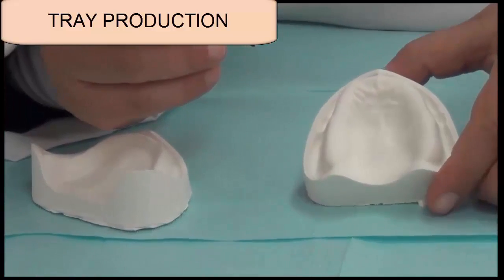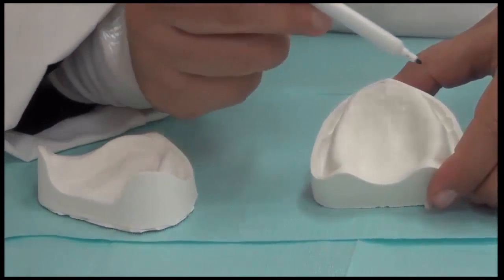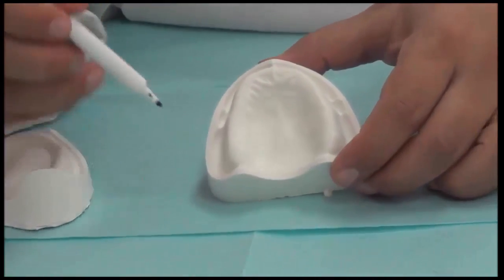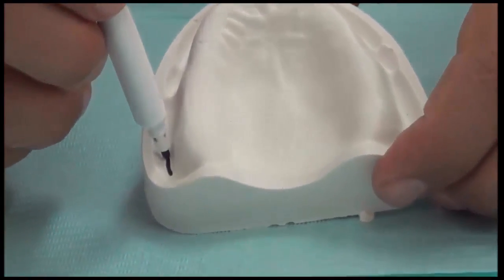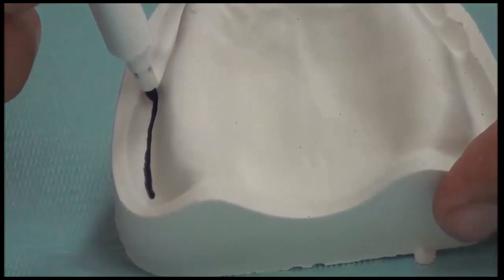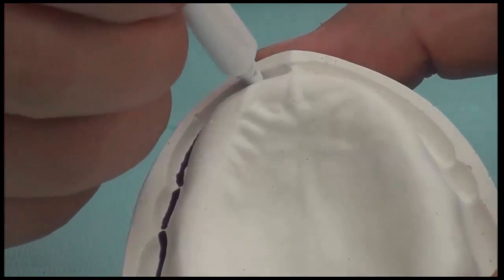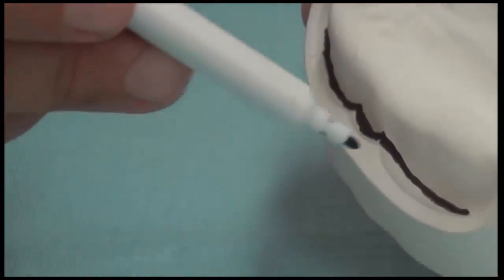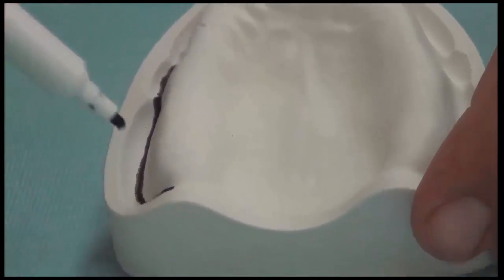So to begin our first step, we need to outline the basal seat area, which is the area that could come in contact with the denture. We begin by holding a pen. We need to know where the depth of the sulcus is. So we hold the pen vertically and we let it run in the sulcus all around the cast. We will find that on the areas of the freni, the pen will go up and down. And this is the sulcus morphology around frenal attachments.